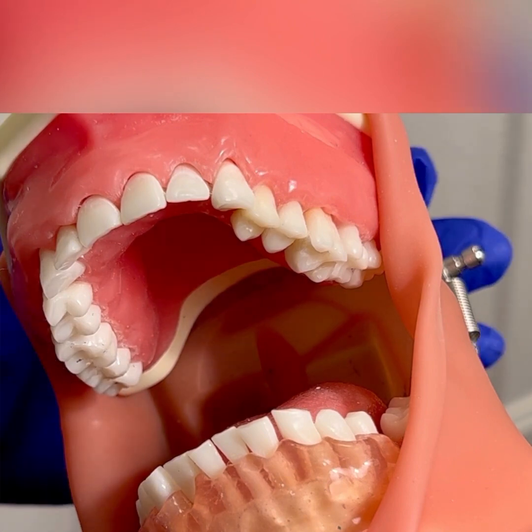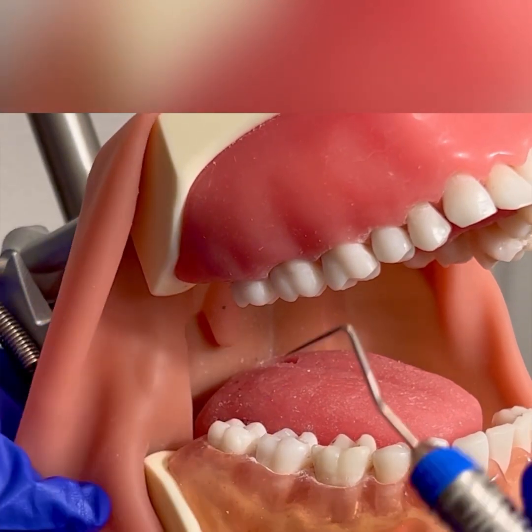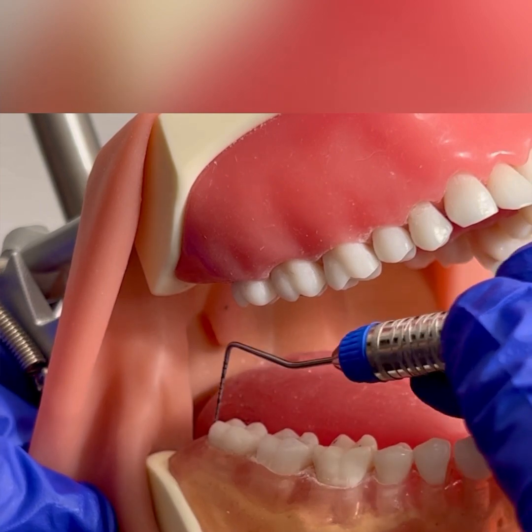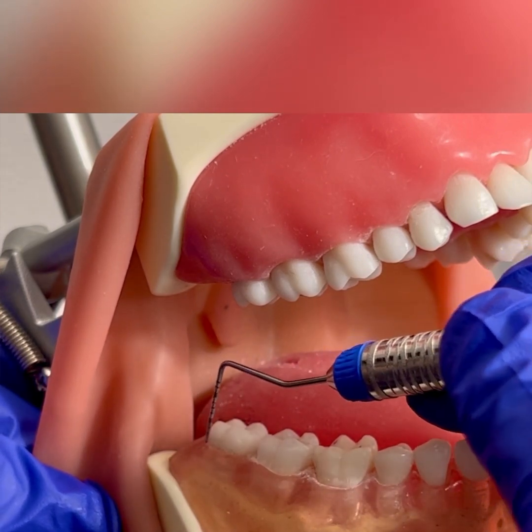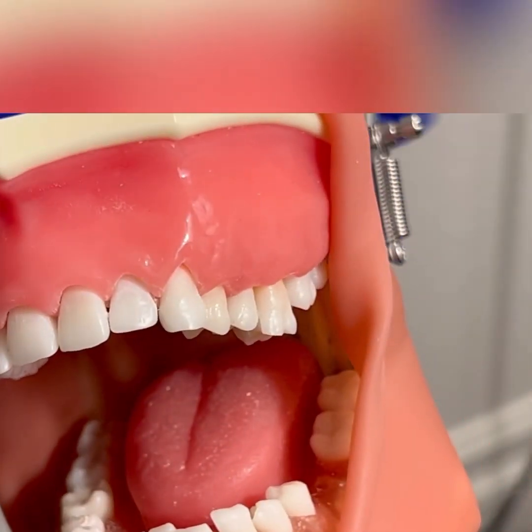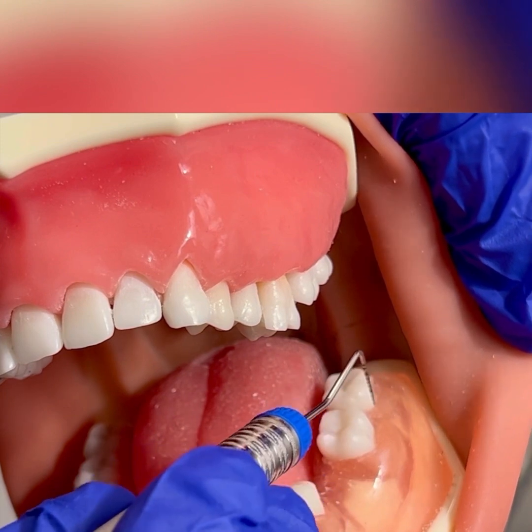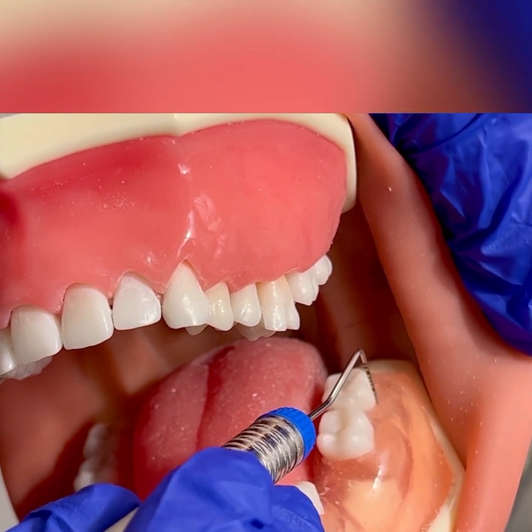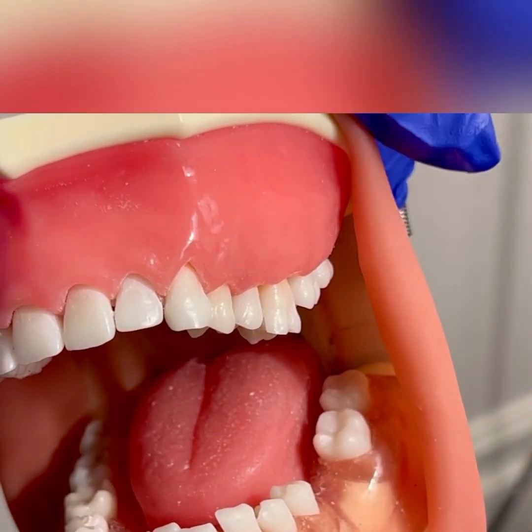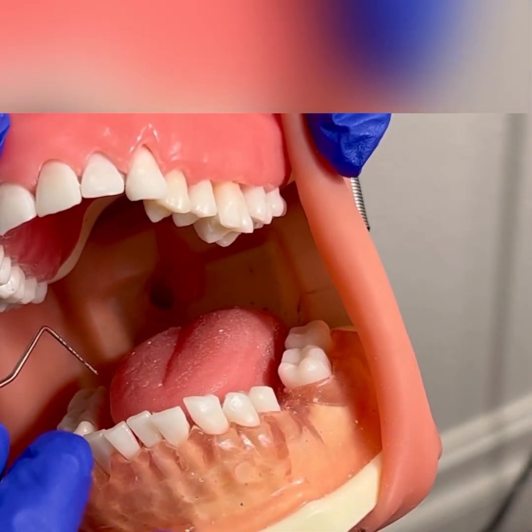Once you finish the whole maxillary arch, you would then drop down, starting with tooth number 32. You would have an intraoral fulcrum because it's the mandibular arch. You would go all the way across the buccal of the mandibular arch to tooth number 17. Once you finish the whole buccal surfaces on the mandibular arch, you would then wrap around to the lingual, and you would end up completing with tooth number 32.